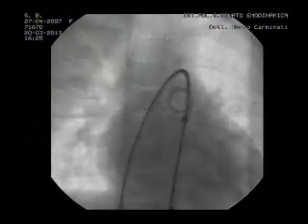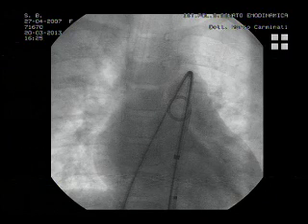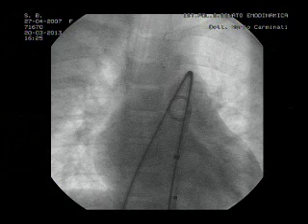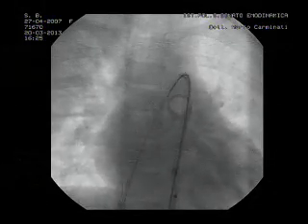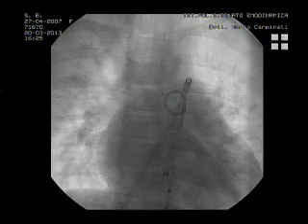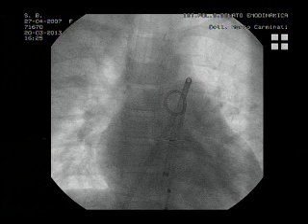Well, actually, I pull fully strongly, Joachim, and I think that the problem was just the length of the duct, or the ampulla, if you like, and the size itself.